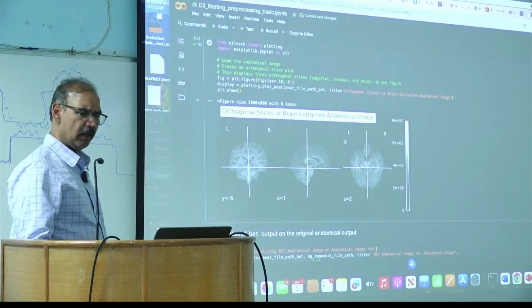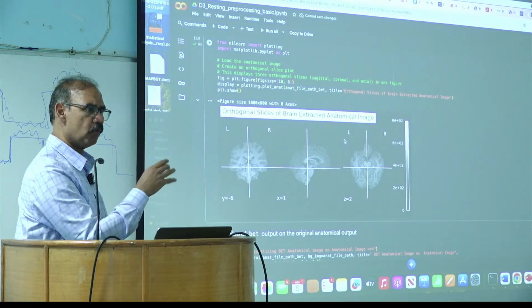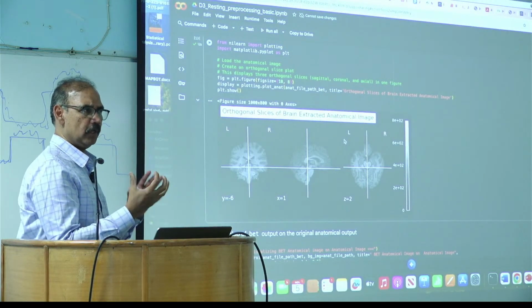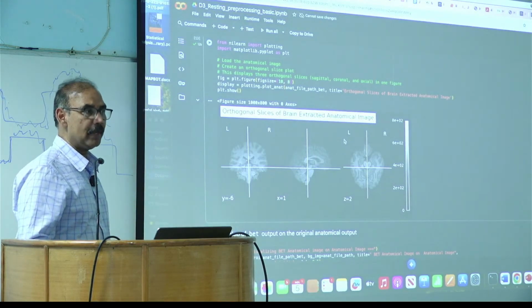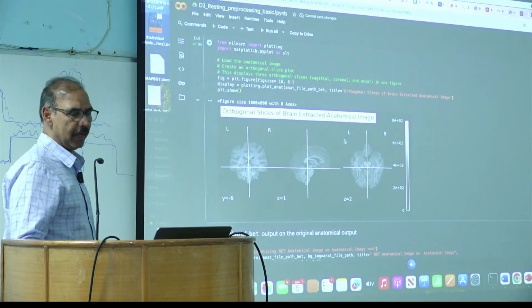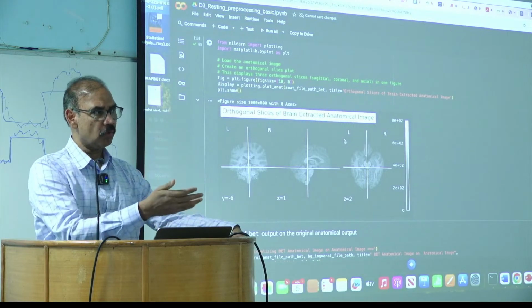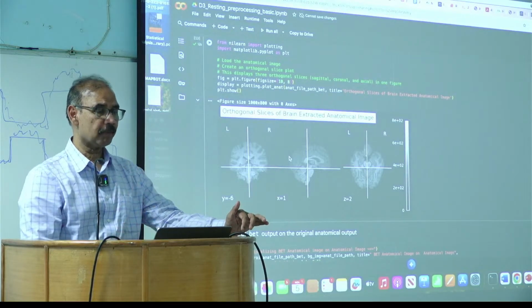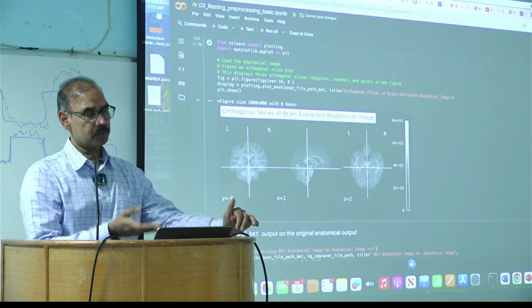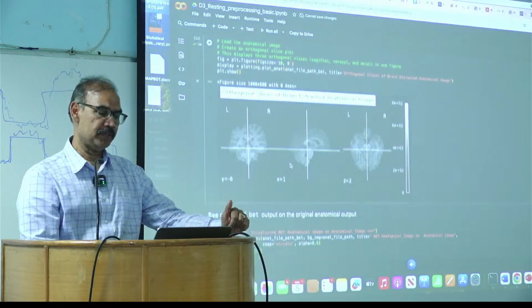Again, I should emphasize that this is not a simple thresholding where we can find the anatomy from the skull, right? There are other methods which are used to find the volume and then exclude everything outside the brain volume. It would not be possible to find the threshold. If anyone can show me, I will be very pleasantly surprised as to how you're setting the threshold. It is difficult, the same thing I showed you yesterday, right? When you set the Z score, whether 2 or 3 or 4, you have false positives and true detections. If you use simply intensity-based thresholding, there will be some voxels inside the brain, like ventricles and so on, whose intensity is less than that of the skull, right? So that is why other features are also used.